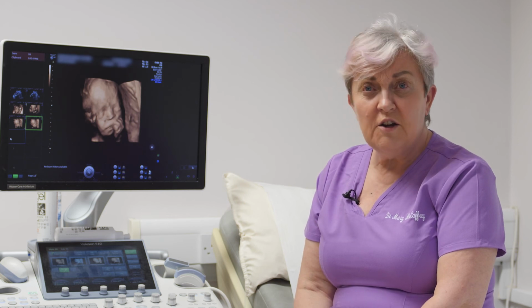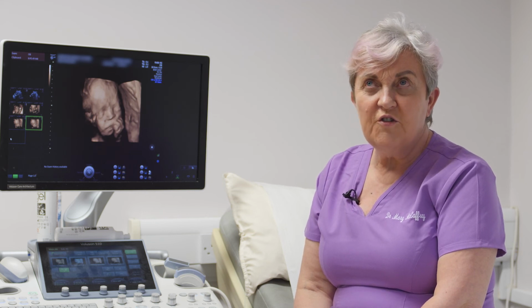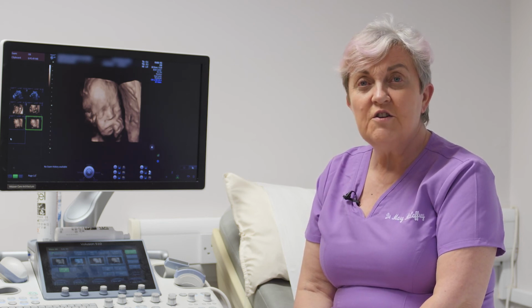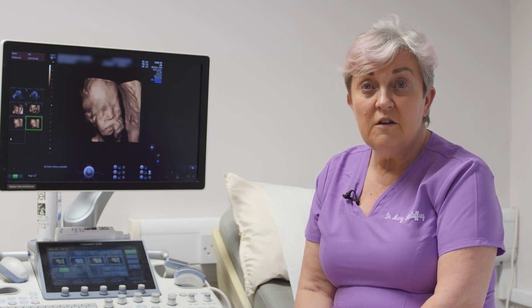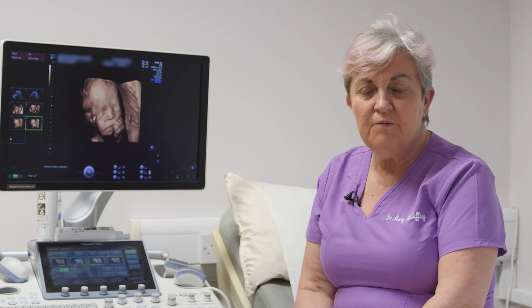Ultrasound scanning in gynecology is becoming very, very big, and 3D scanning in gynecology is making ultrasound nearly as good as MRI scanning, and in the States they would say they're almost equivalent for a lot of things. So a lot of our patients who are coming for a gynae appointment for heavy periods or fertility or whatever will have a gynae scan almost 90% of the time. It's part of the care that we offer them, and it can replace going to theatre for hysteroscopy in some cases. It allows us to assess heavy periods and postmenopausal bleeding. So like I say, ultrasound in women's health is now a huge part of what is done.